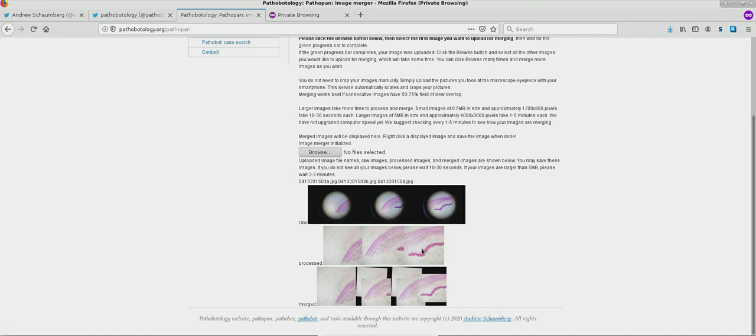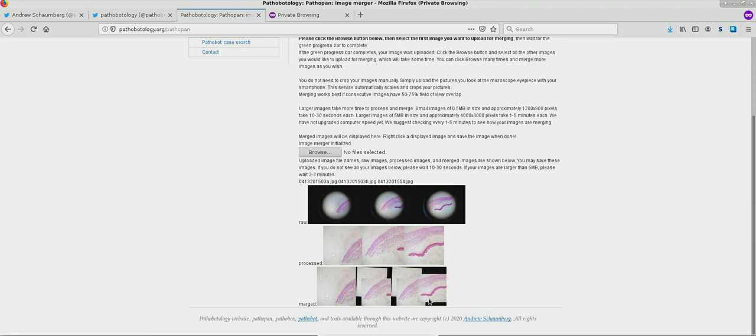But in this third image, there is additional information that we see. And this shows some of the utility of this merging tool now that we have more information merged here in an image. More information than any of the single fields of view above it.